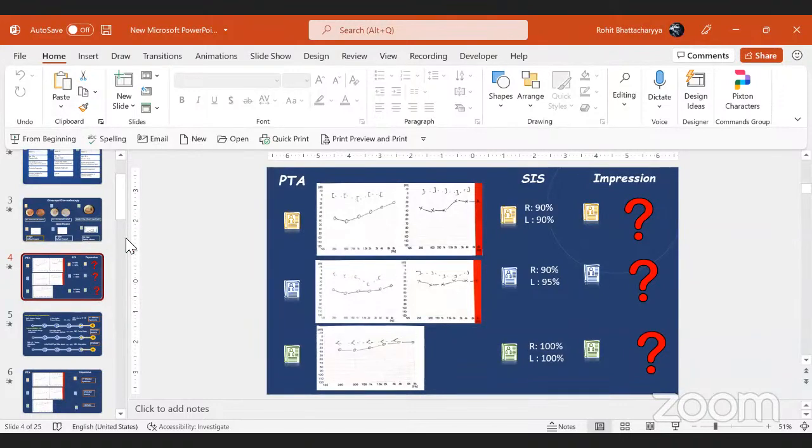Maybe there is an inner ear pathology involved, or even in case of the, what was the other one? Even in the other case where you got a C-type. What led you to think that it's not straight away the first thing that comes to your mind, what led you to think differently, or was it after discussion with the ENT, or did you also think that there may be something different?